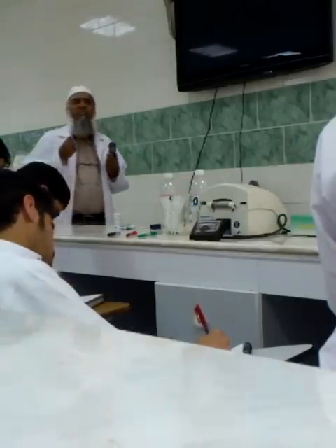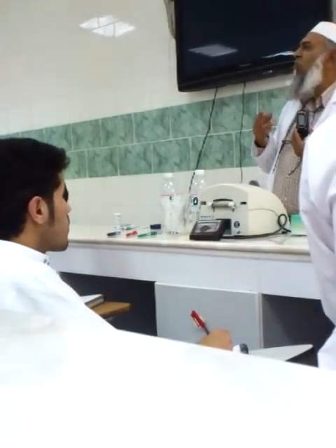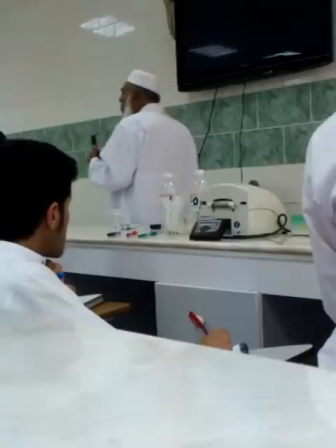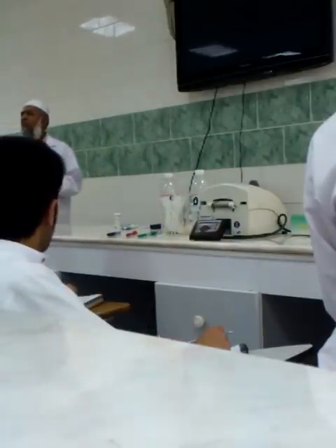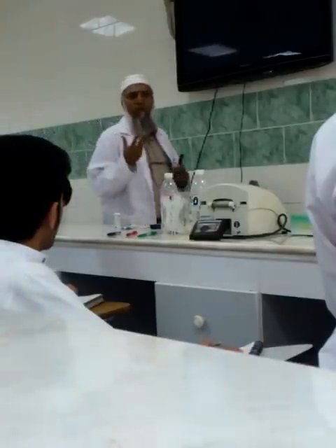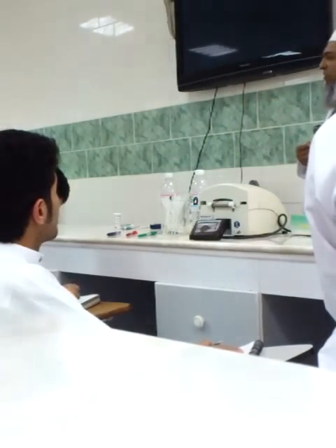Because diabetics, in many cases, particularly those who are on insulin, have to measure their glucose every time before injecting insulin. In that case, it was very difficult for them to go to the lab every time and get their glucose checked.